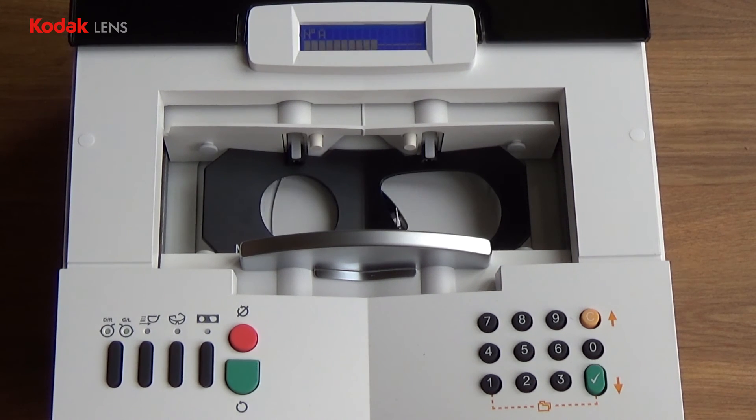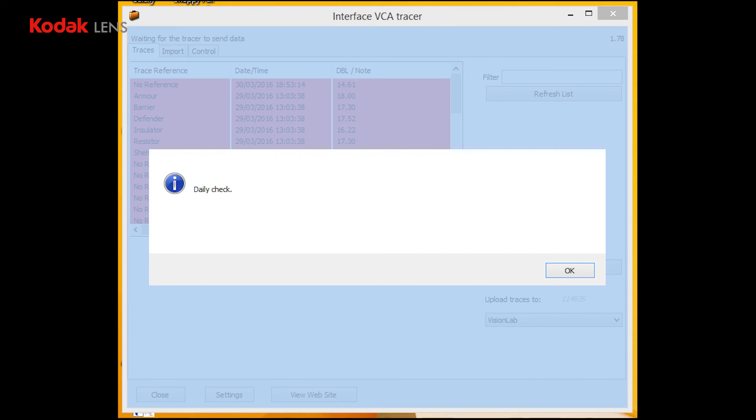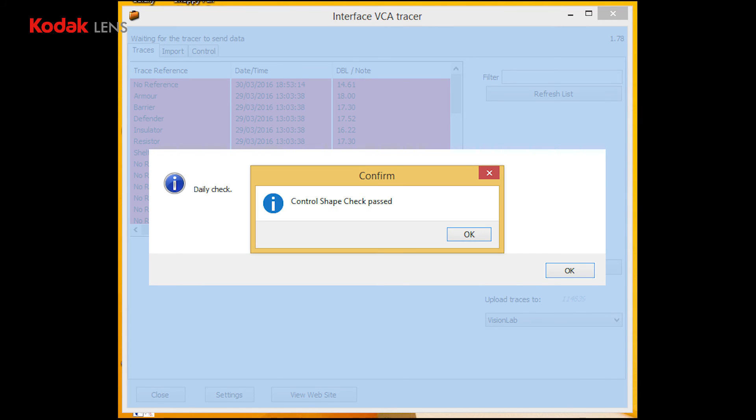There has been no change in the ring. The trace data will now be transmitted to the software, and if the trace is a good trace, the control shape check will pass.